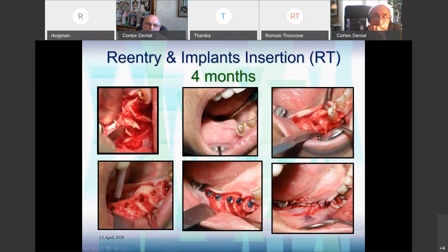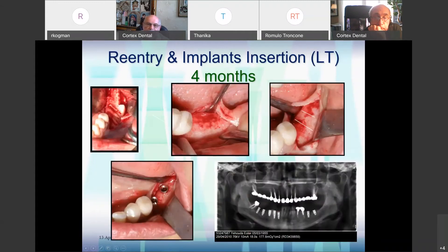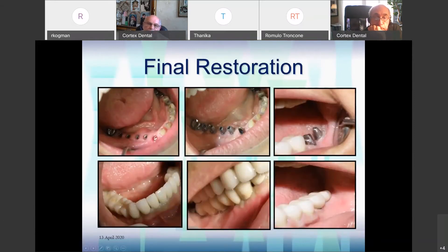When we opened for the implant placement, you can see some bone was missing, so after inserting the implant we filled again with bone in this area. The final result: we started with this on the left side — look at the nice crest. And on the right side — look here. And with the final restoration.